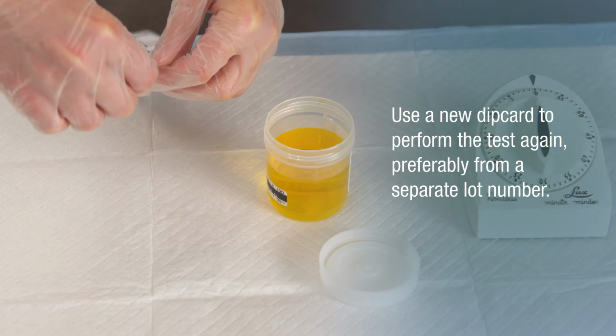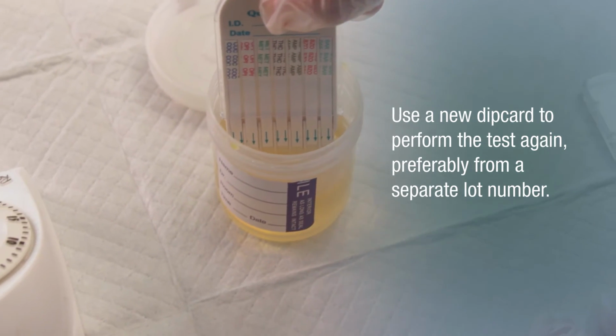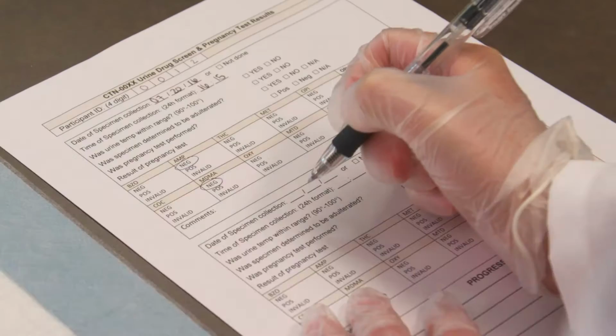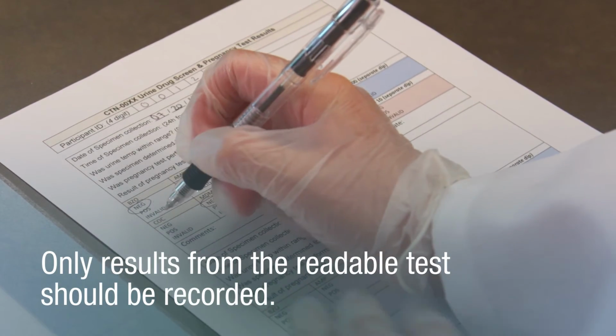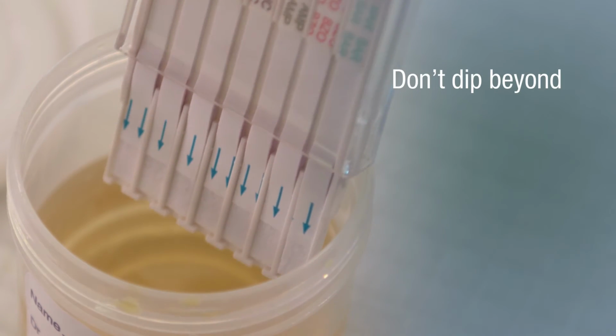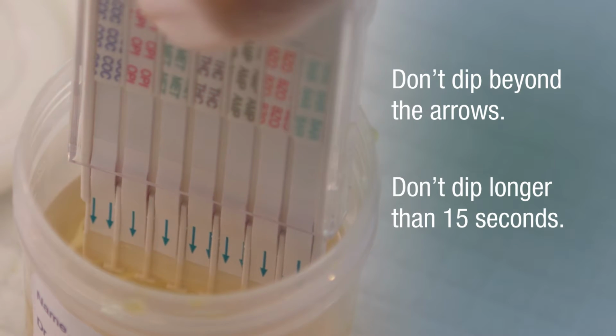If site staff is unable to read the test results due to a faulty dip card, a new dip card should be used to perform the test again, preferably from a separate lot number. This should be documented in the notes, but only results from a readable test should be collected and recorded. Here are a couple of suggestions based on 2 of the most commonly occurring errors when performing a urine drug test. Don't dip beyond the tip of the arrows, and don't put in urine for longer than 15 seconds.